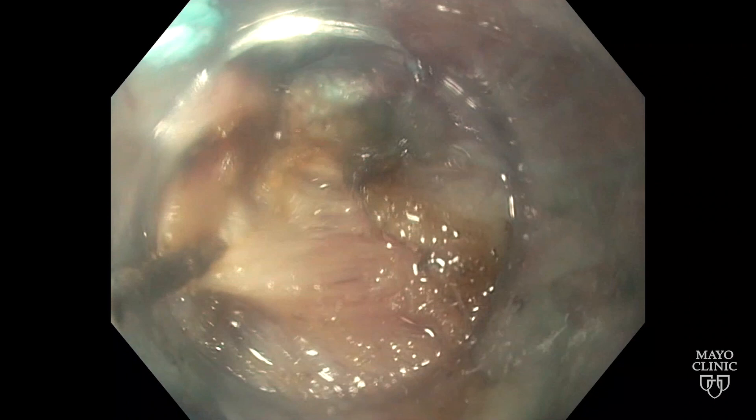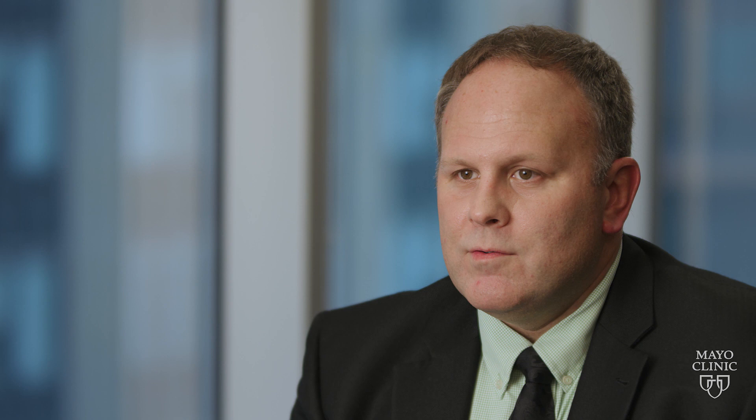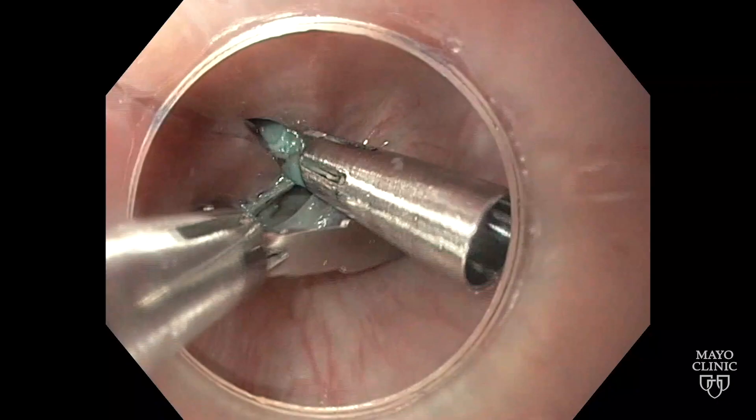The only requirement at that point to prevent adverse events is proper closure of the tunnel that's been created, which is usually a one to two centimeter opening at the very proximal aspect of the esophagus. A major benefit of the Zenker's POEM approach is the ability to preserve the overlying mucosa of the proximal esophagus, therefore minimizing the risk of infection after tunnel closure.